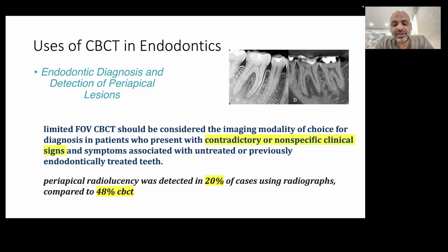When there are contradictory and non-specific signs, when the patient بيشكي من pain, usually we could take a CBCT to verify the presence of periapical lesion. في الحالات اللي المولرز زي هيك ممكن الفيتاليتي تيستينج تكون inconclusive، ما تعطيني ريزلت دقيقة، يكون جزء من السن فايتال ستيل، فبعطيني ريزلت أو بعطيني ريسبونس على الكول تيست أو على الاي بي تي. وبهيك حالة taking the CBCT will help me to detect the periapical lesion.